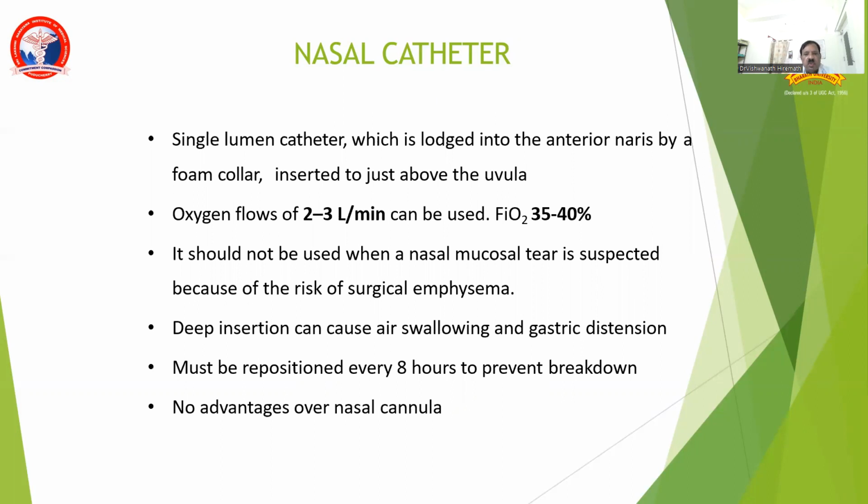It should not be used when nasal mucosal tear is suspected because of the risk of surgical emphysema. Deep insertion can cause air swallowing and gastric distension. Must be repositioned every 8 hours to prevent tissue breakdown. They are not having much advantage over nasal cannula.